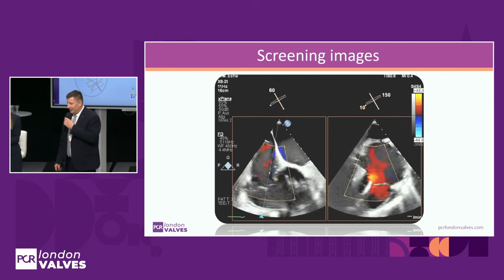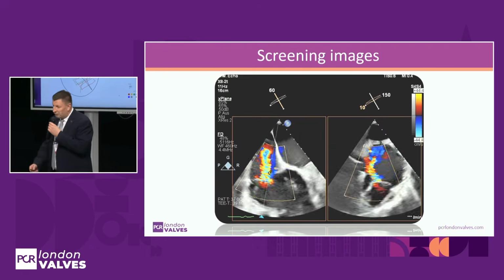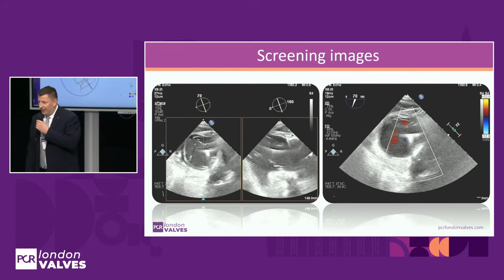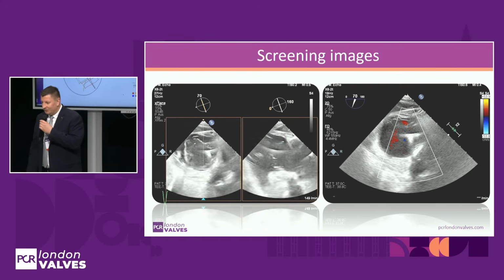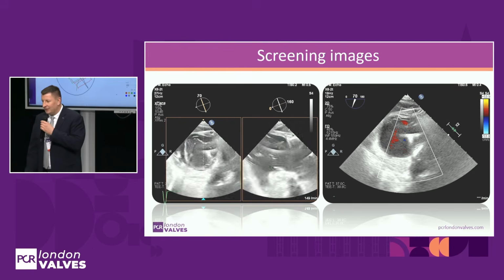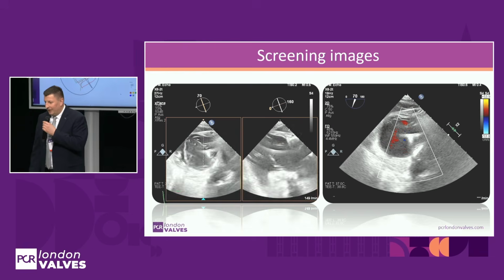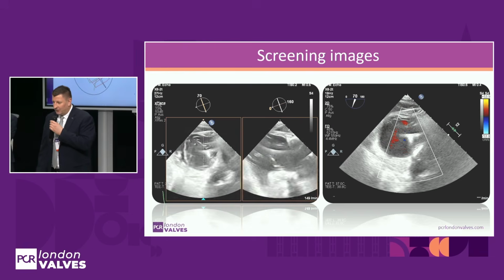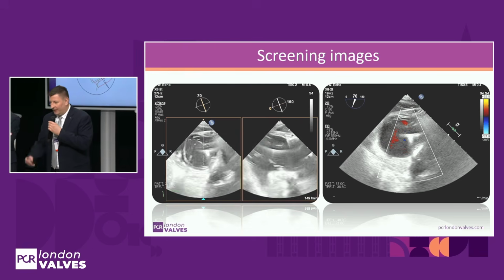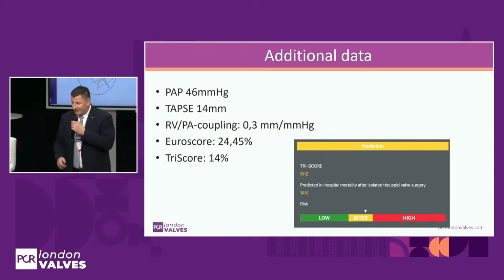You see here the lead inserted and the massive primary, or lead-induced, tricuspid regurgitation. The lead normally lies on the septal posterior side. Here it's exactly in the middle of the valve, opposite of the anterior posterior commissure and connected with the septal leaflet. And there is also the tricuspid regurgitation coming from exactly this side.